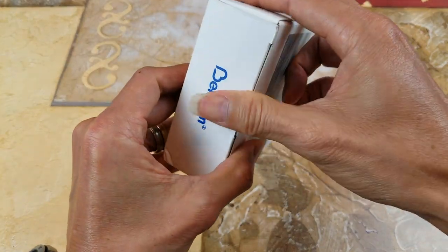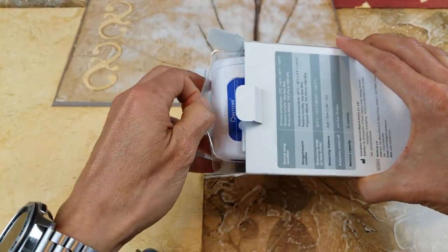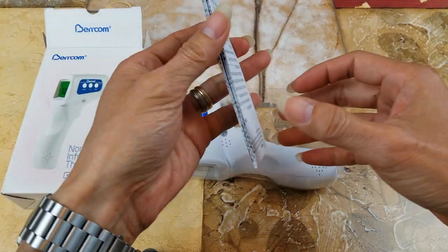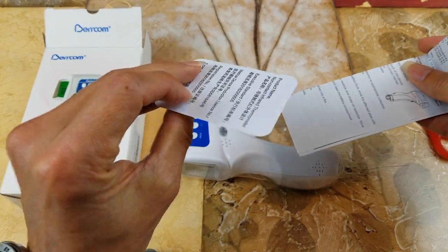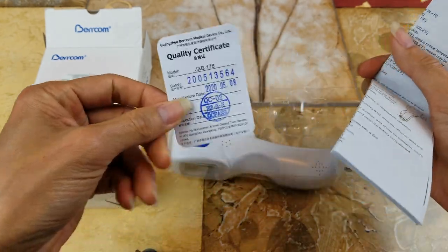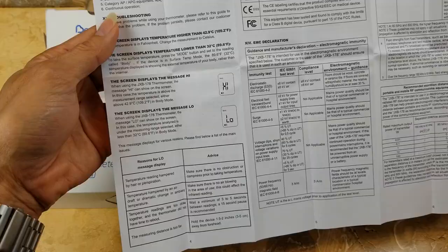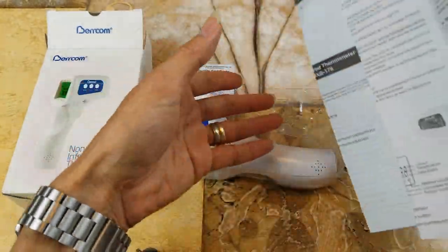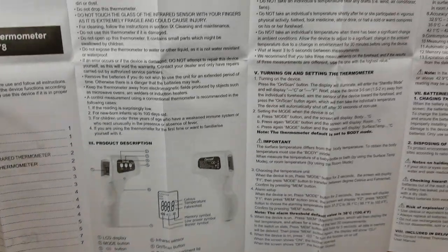Let's go ahead and open this up. It comes with instructions and also a quality certificate. Hopefully this comes with a battery.